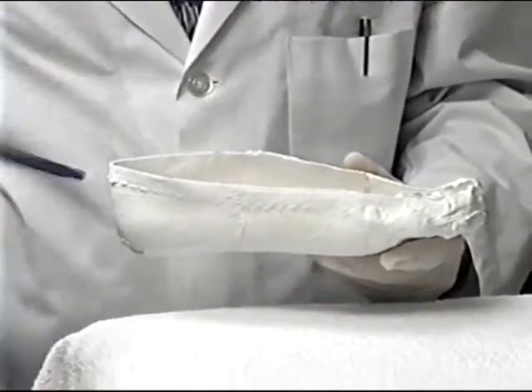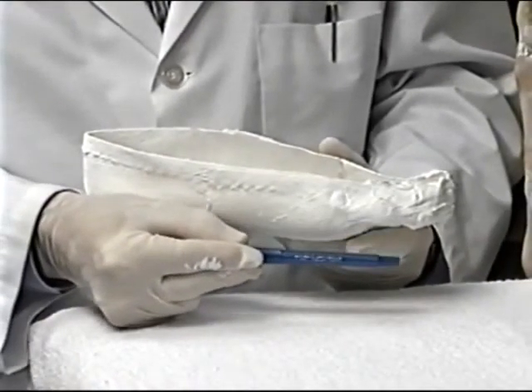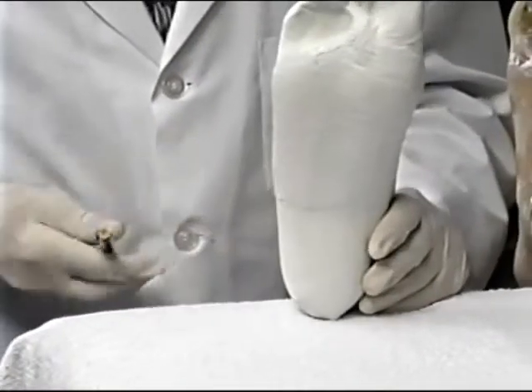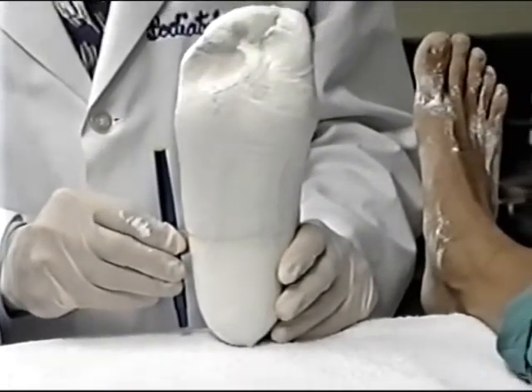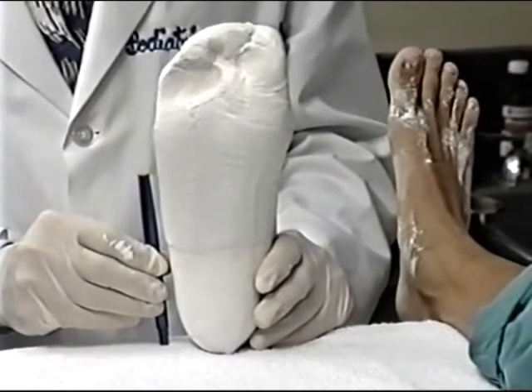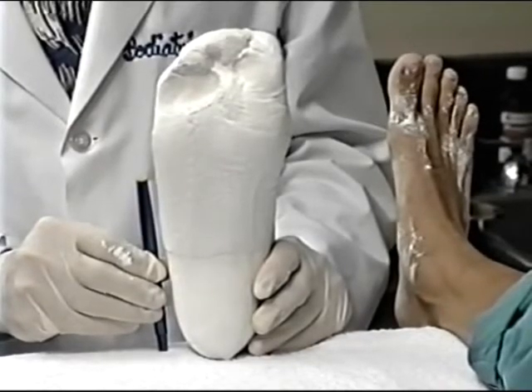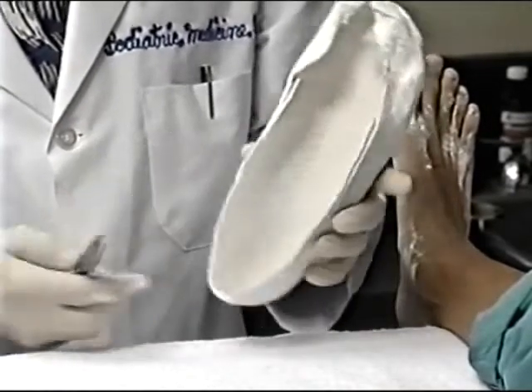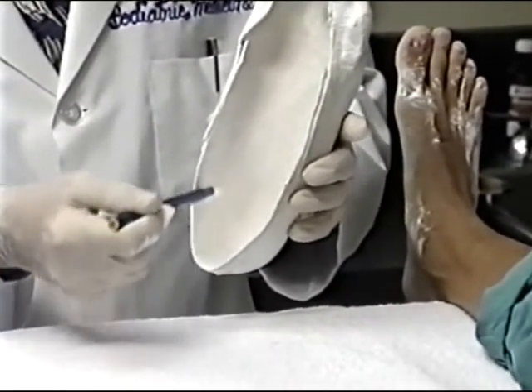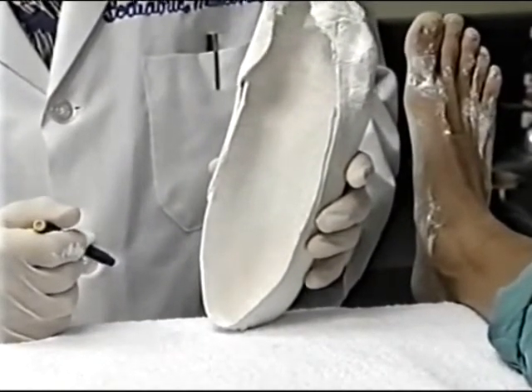Evaluate the cast by checking the following seven points. One, make sure the fifth toe is neither dorsiflexed nor plantar flexed on the lateral side of the foot. Two, make sure the lateral border of the cast is straight or slightly abducted; the lateral border may be adducted only in the case of a patient with metatarsus adductus, in which case the lateral side of the cast will appear C-shaped. Three, the inside of the heel should be concave from medial to lateral, as well as symmetrical around the outside. An asymmetrical heel sometimes indicates the foot was held with the subtalar joint pronated.